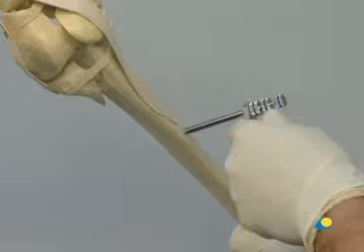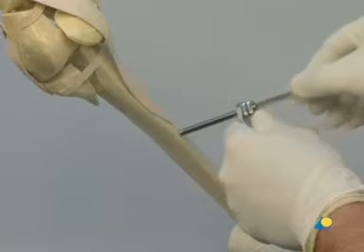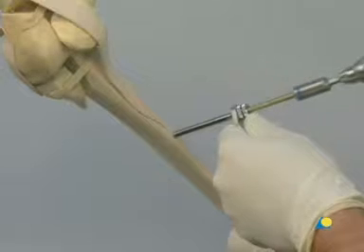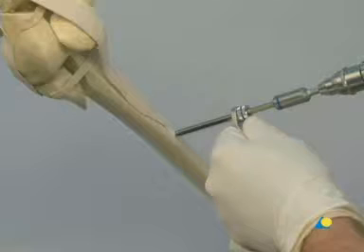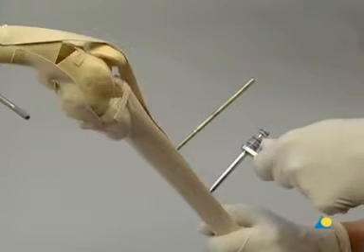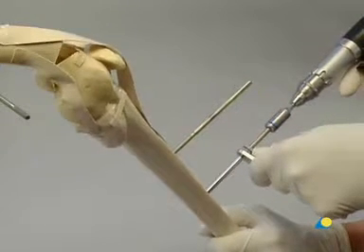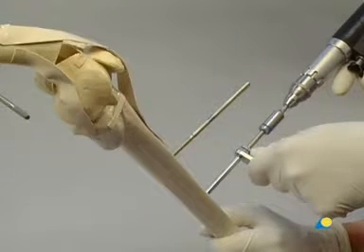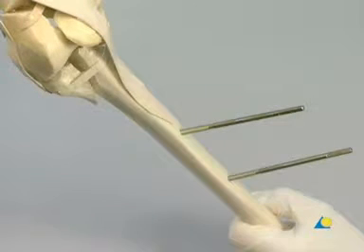Two Schanz screws will now be inserted into the tibial shaft using the same technique. The first of these screws should be placed in the mid-sagittal plane, about one centimeter medial to the palpable tibial crest. After the trocar is removed, the Schanz screw is advanced using the power drive until it is secure in both the lateral and medial cortices. Another Schanz screw is introduced in the same manner into the tibial shaft, distal to the first. To improve the stability of the external fixator, the Schanz screws should be widely placed. Here the final placement of the Schanz screws can be seen.